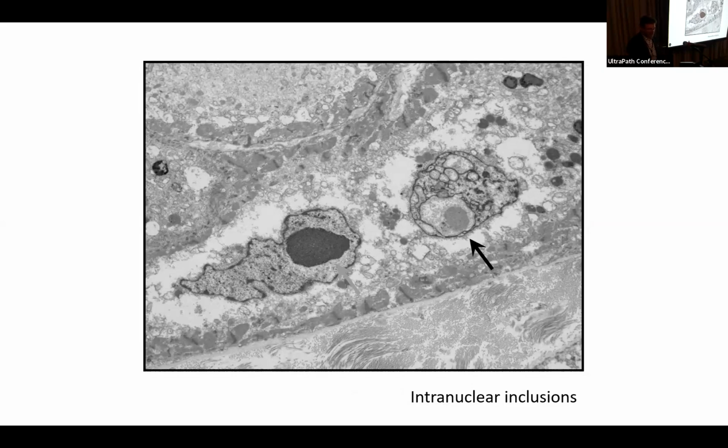This image here is a cardiac biopsy from a patient that was suspected of suffering from a viral myocarditis. The light microscopic examination revealed the presence of intranuclear inclusions, a feature that might represent accumulation of viral particles.